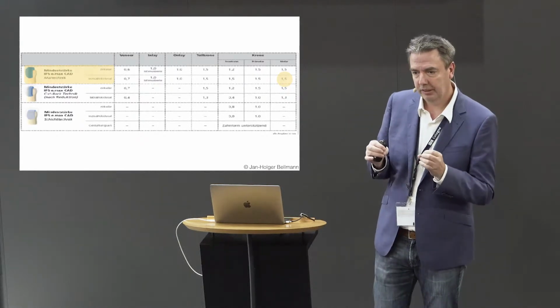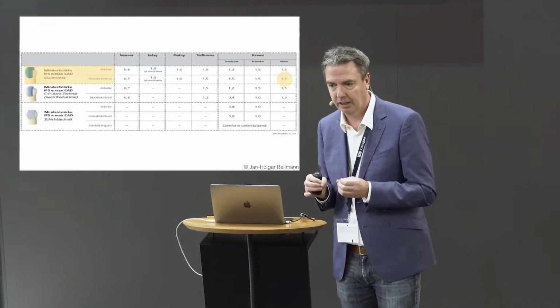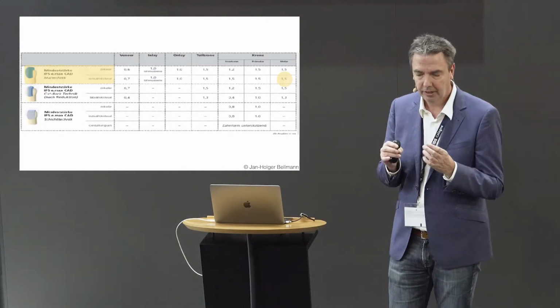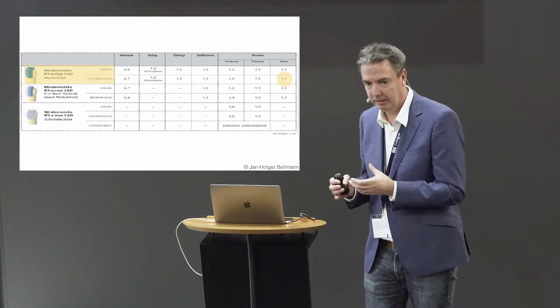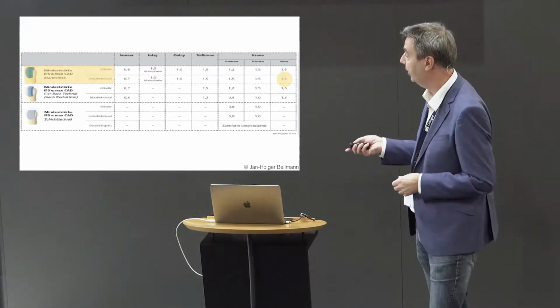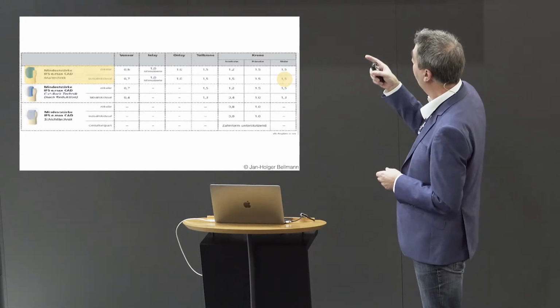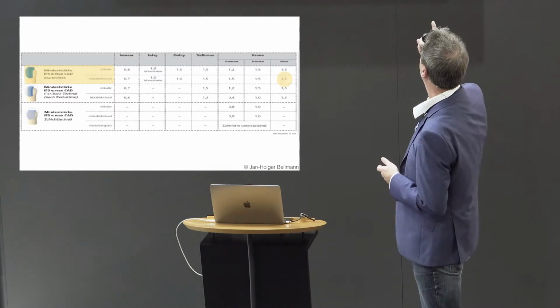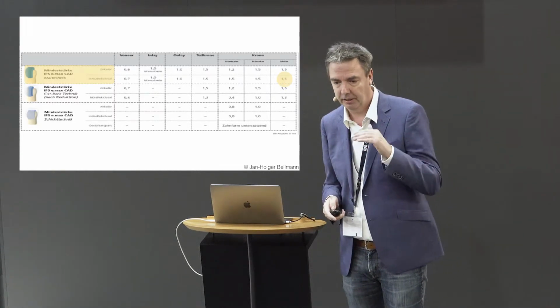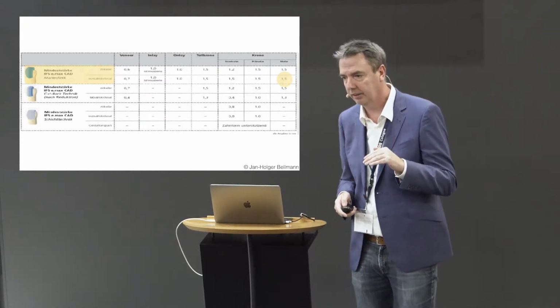Always keep in mind the recommendation of the manufacturers of the material. How much space do you have to create to get a long-lasting result? Because otherwise you will see fracture problems over the period of time. For Emax, we have a minimum thickness on the molar of 1.5 millimeters. And if you don't follow these rules, you will directly run into problems.